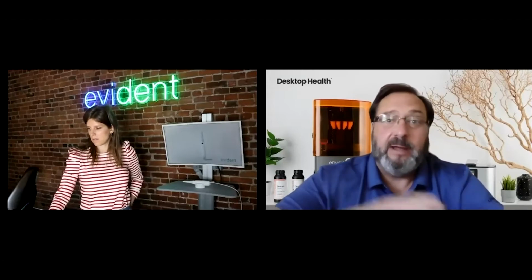And that IFU would also be a class 2, used for permanent restorations in the mouth. So even though we have 2 materials, they're going to have 2 class 2 FDA cleared restorations. They're going to have 2 different IFUs, one for permanent crowns and one for permanent dentures. Okay.